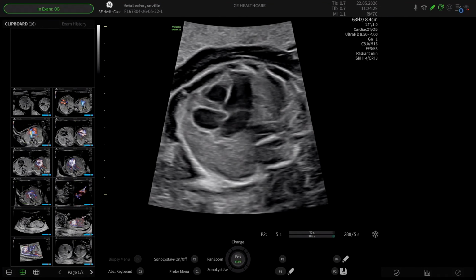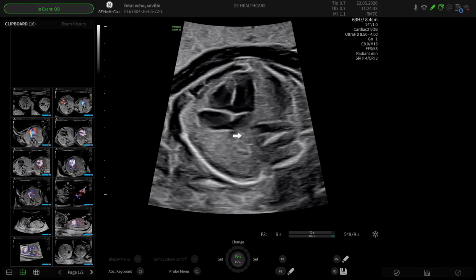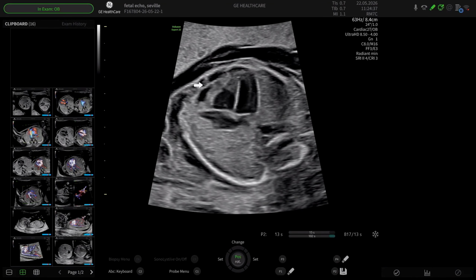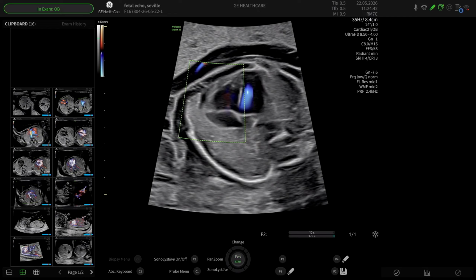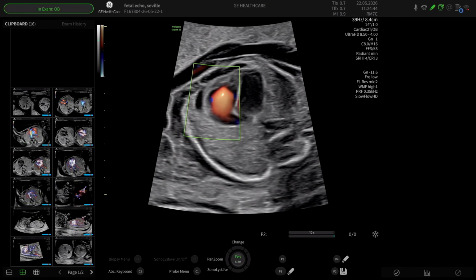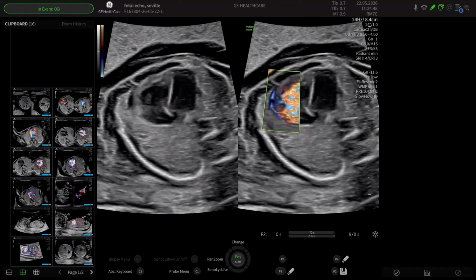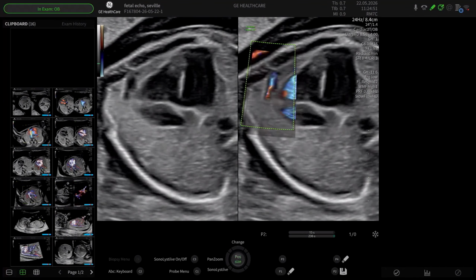As I'm looking at the heart, I see that 2/3 of the heart is in the left hemithorax and 1/3 of the heart in the right hemithorax. I see there's some free fluid around the right pericardial space. Again, just to show you the power of this technology, it doesn't show up on Doppler, but it does show up in slow flow. And as I split my image, I then reduce my balance. And as I crank that image up, I can then now see my balance.